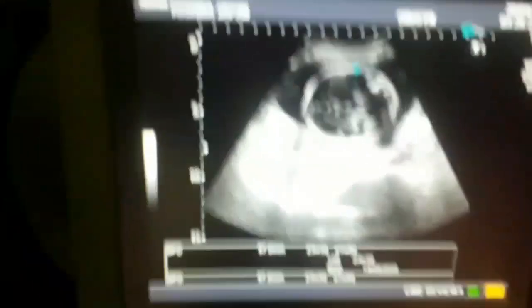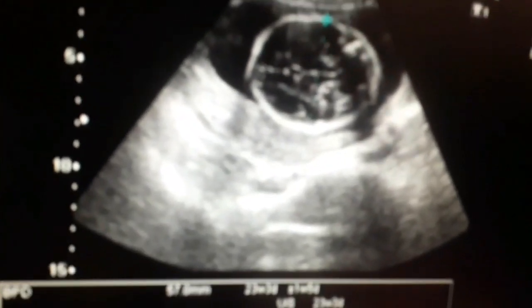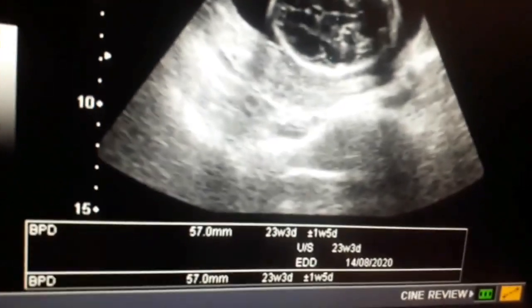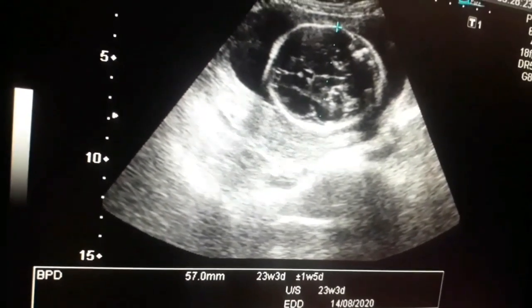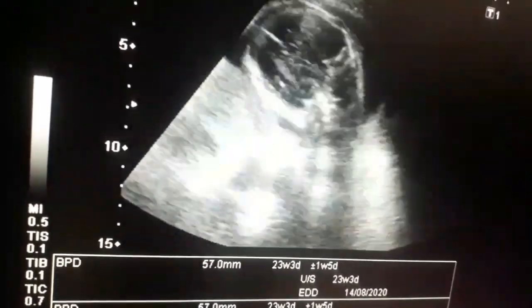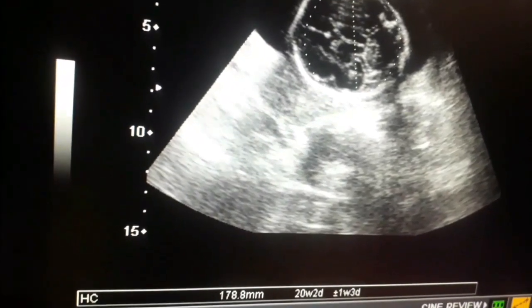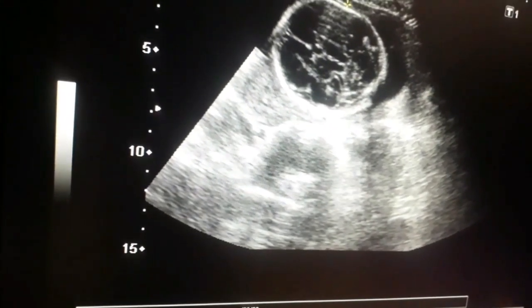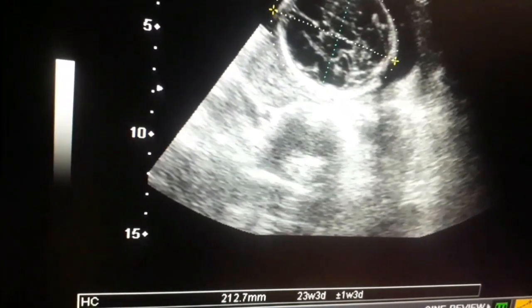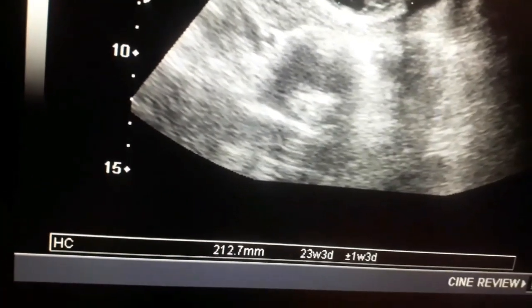This is an ultrasound of a 22-week pregnant lady. First, I am fixing the head of the baby — it is in cephalic position. The biparietal diameter is about 23 weeks. I take it from the outer to the inner side of the parietal bone on both sides. The line is intersecting the thalamic area, and in the midline there is a slit of the third ventricle. Now I will take the head circumference, covering the outer table of the bone on both sides in the longitudinal-transverse position — it is about 23 weeks.